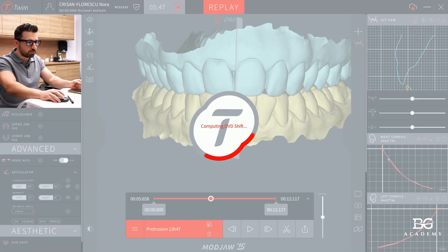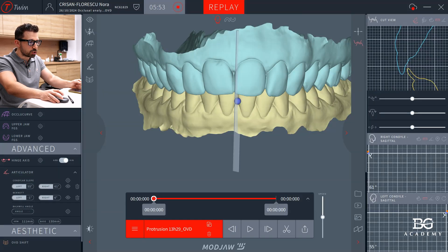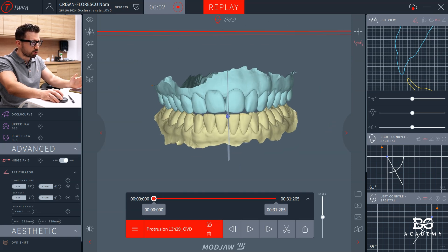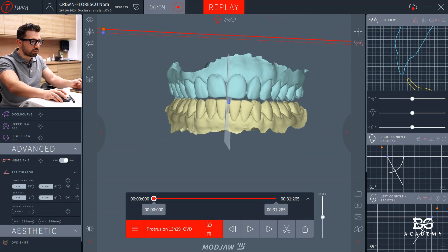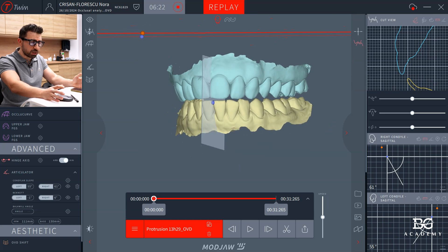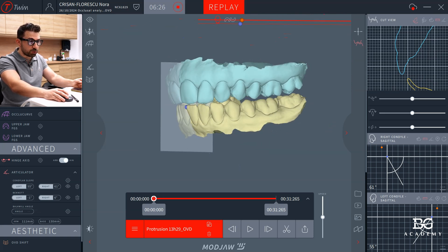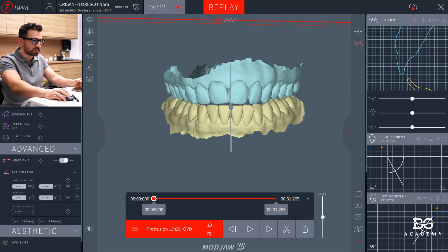We can now save this position and confirm. This position will be used by the dental technician to create the splint. We'll then check the position with the splint, and if everything is okay — no pain, no muscle reaction, no click — we will proceed to the next treatment step. In this case it's an orthodontic case: you can see a very steep position of the incisors and upper teeth. We need to make the upper arch larger, which will automatically create freedom for the lower jaw to move forward, giving a predictable and comfortable result.